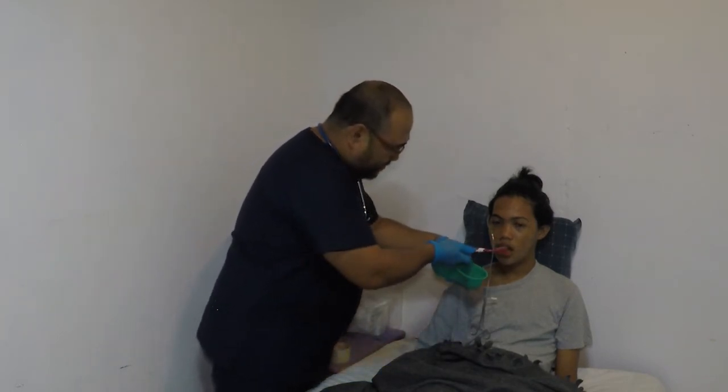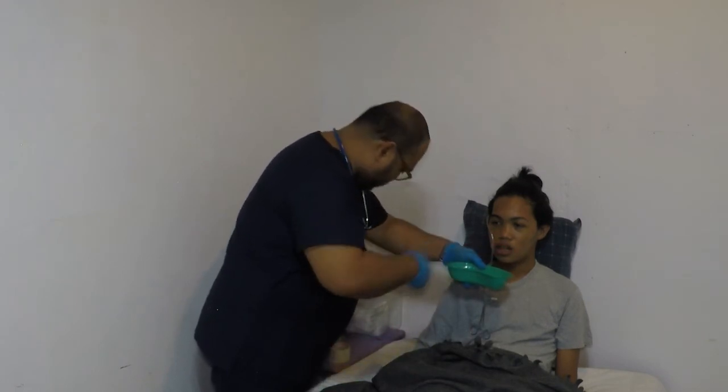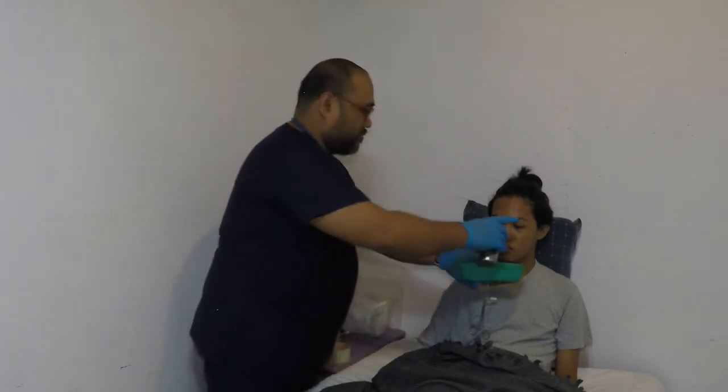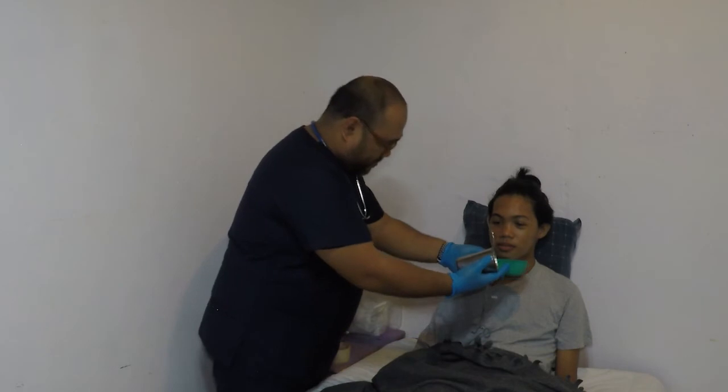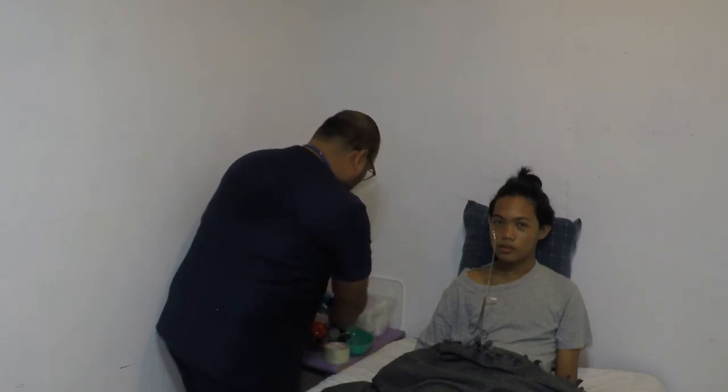Then we will do mouth care. Then we will provide mouth care by brushing the teeth. Then offer mouthwash and keep lips moist. Then clean and replace the equipment to proper place to prevent contamination of equipment and prepare for the next procedure. Then remove gloves and perform hand hygiene to prevent spread of infection.